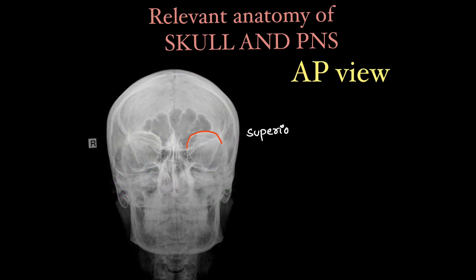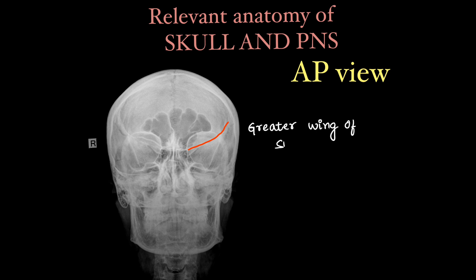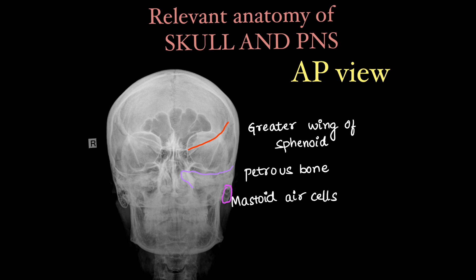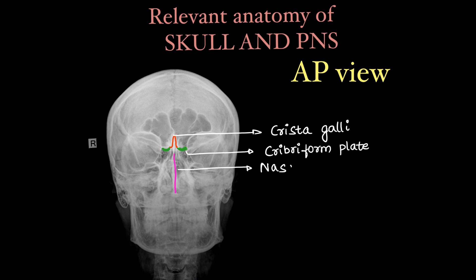We have some additional structures which are visualized on AP view of x-ray: the superior orbital ridge, the inferior orbital ridge. Next, through the orbit we can see the greater wing of sphenoid on both sides, the petrous bone, the mastoid air cells, crista galli — part of the ethmoid bone — the cribriform plate, bony nasal septum, and the bony part of the inferior turbinate.